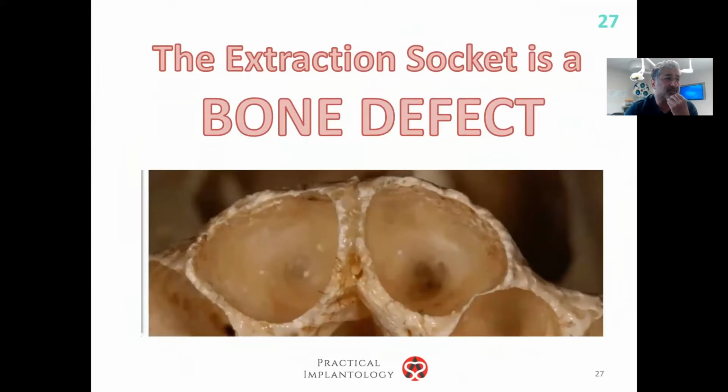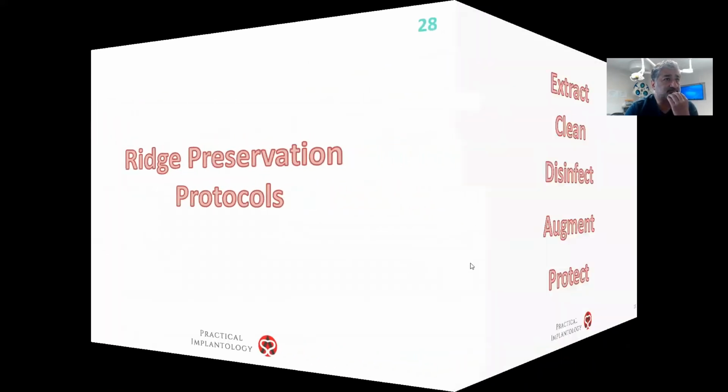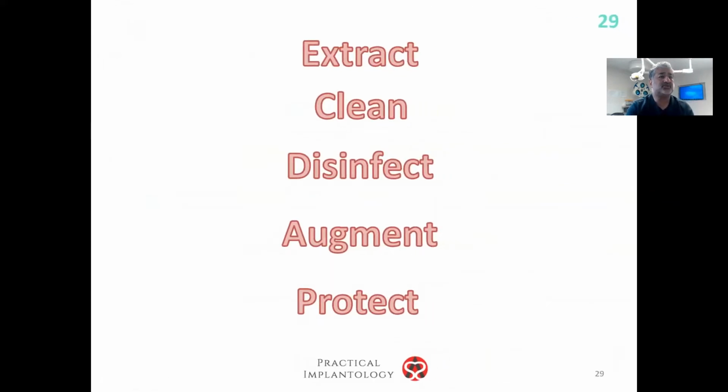The extraction socket is a bone defect. Remember that. Because it's a bone defect, I would like to try to, in some way, augment it, to give it a chance to reduce the amount of defect. So the ridge preservation protocols: we extract. When we extract, we don't do figure of 8 anymore. We try our best to trisect, bisect teeth. We then clean the socket. We disinfect it. We clean by removing any granulation tissue that might be in there, any infected soft tissue that might be in there. We then disinfect. We then augment, if we're going to augment, and then we protect. Anyone, even if they're not going to augment, should be cleaning, disinfecting, and then protecting that wound. That's what I feel.